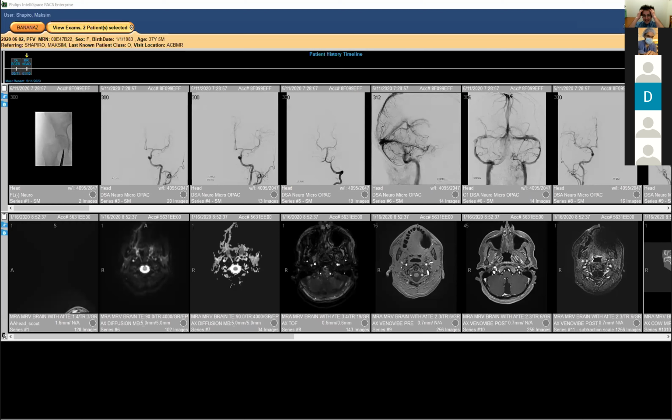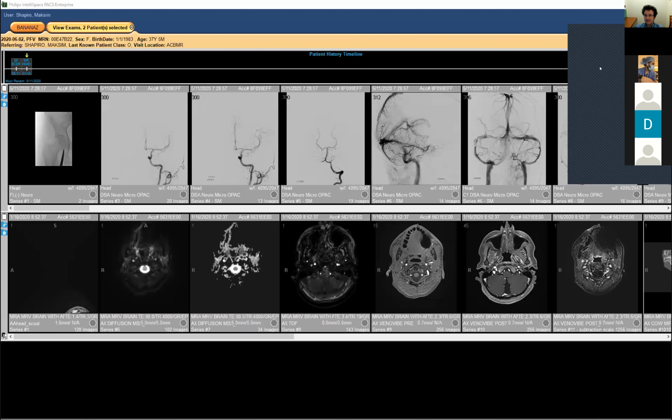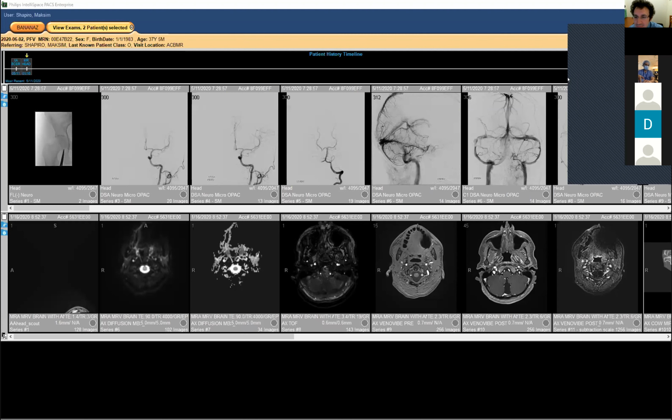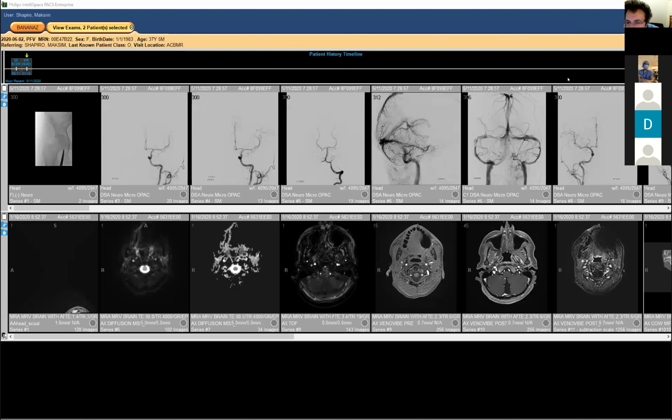Dodi, thank you. No, this is great. Although it does raise an interesting question, if you don't mind, Dodi. Let's just take the example of the basal vein of Rosenthal, where Max shows the basal vein, instead of emptying into the vein of Galen posteriorly, entering a vessel on the tentorial surface.